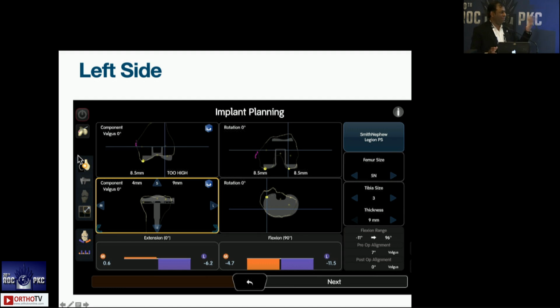Anyone who wants to, Mahesh? This is the pre. This is tight, or this is so tight? Anything below is tight, anything above is loose. Yeah, that is the problem. Anyway, you are using some robotic, you see the other screen, you have no clue what's happening. Okay, yeah. So anything below is tight, anything above is loose. In flexion gap it is tight, in extension gap only the lateral is tight.